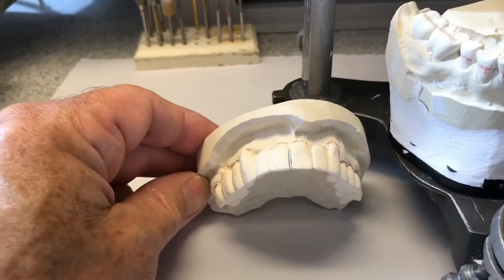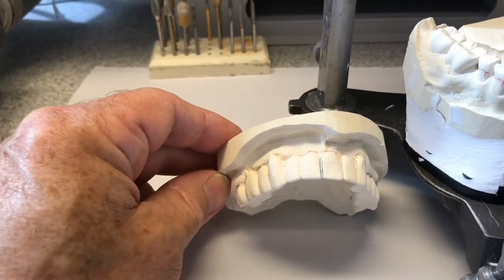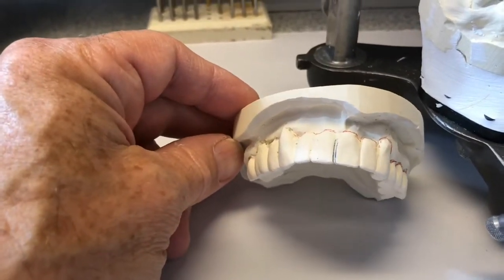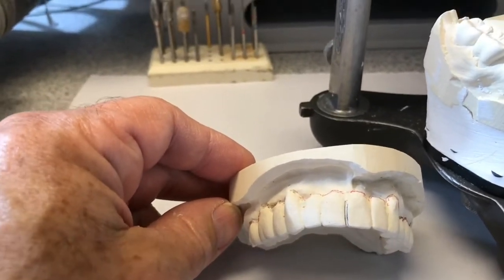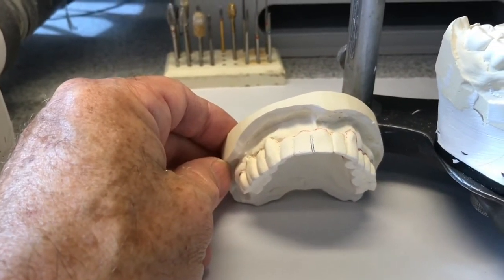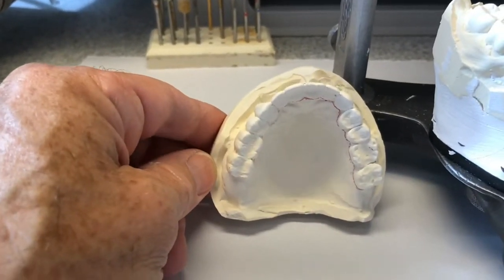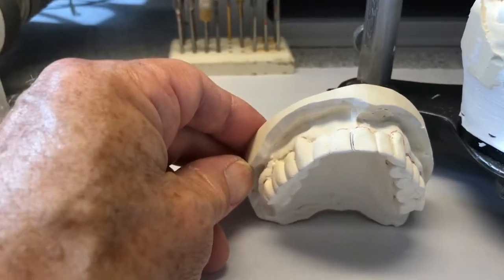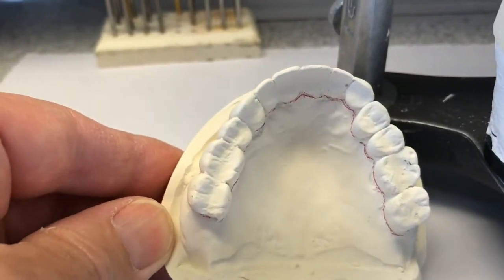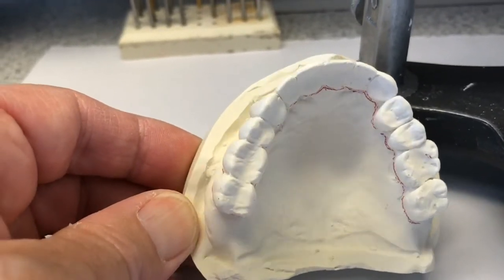I want to take a minute to talk about immediate complete dentures while I've got a case I'm in the middle of here. I've got a patient who had a full mouth reconstruction with a six-unit anterior bridge where the patient's natural tooth was positioned more in the middle of the face, so the midline was way off. It's all failing, and the patient needs a complete denture. We're going to be doing full mouth extractions on this arch, and the denture is going to be placed immediately so they don't have to go without teeth while the ridge resorbs.